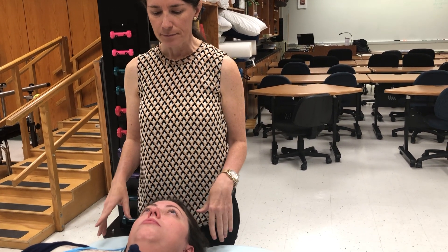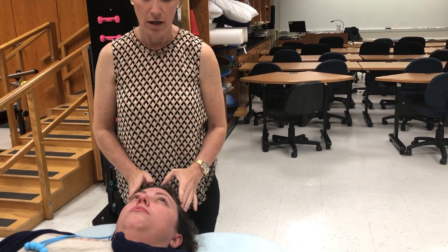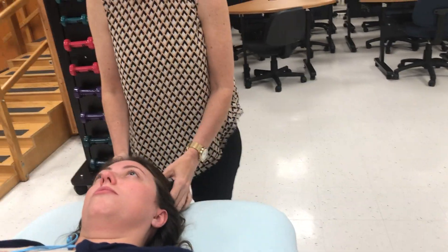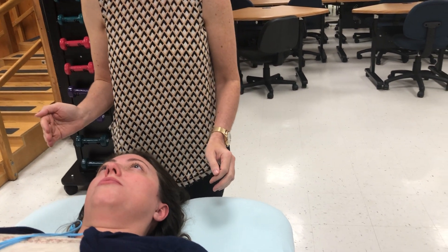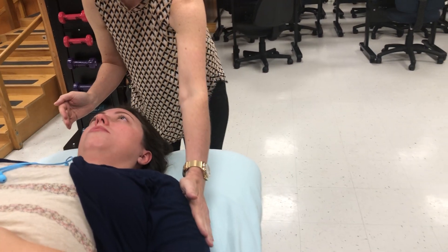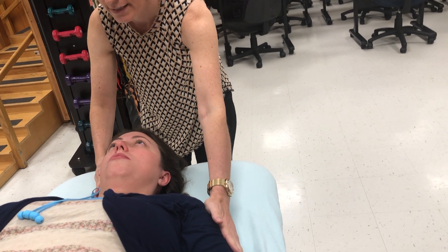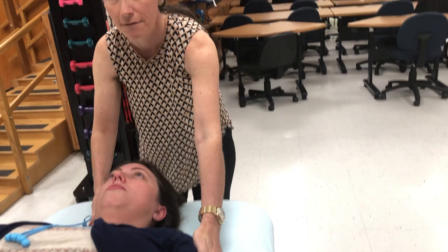Now we're going to test right rotation — the strength of her right rotation. We would have her turn all the way to the left. Turn back up toward the ceiling — that's her grade 3. I'm going to try to push you back toward where you came from, don't let me do it, stay strong. Stabilization on the lateral side of the shoulder, resistance hand right above the ear and the side of the head. So that was my 4 and my 5.